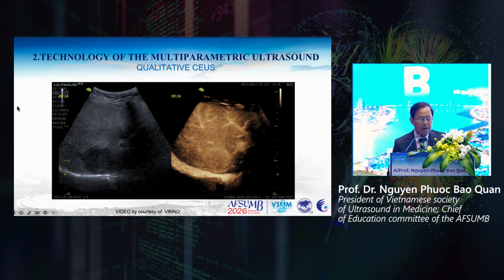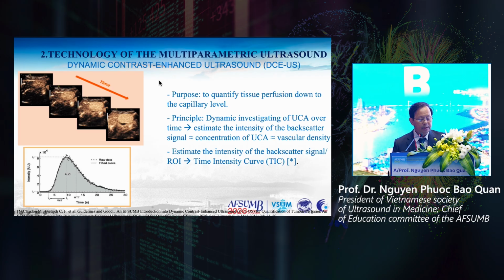And we can use dynamic contrast-enhanced ultrasound to have a quantitative measurement of the enhancement of the liver lesion.